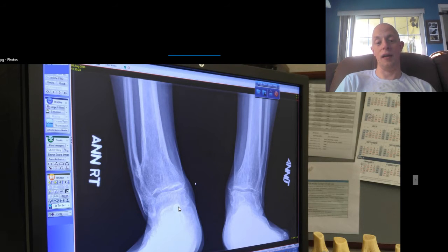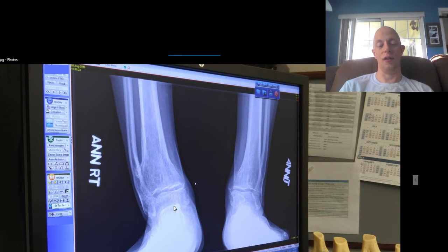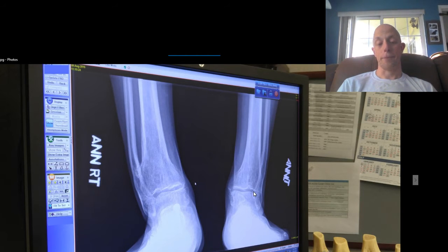This is caused — you can't really see it in this photo here — but it's caused by the actual screw down here that they fused previously. That's causing all the arthritis.